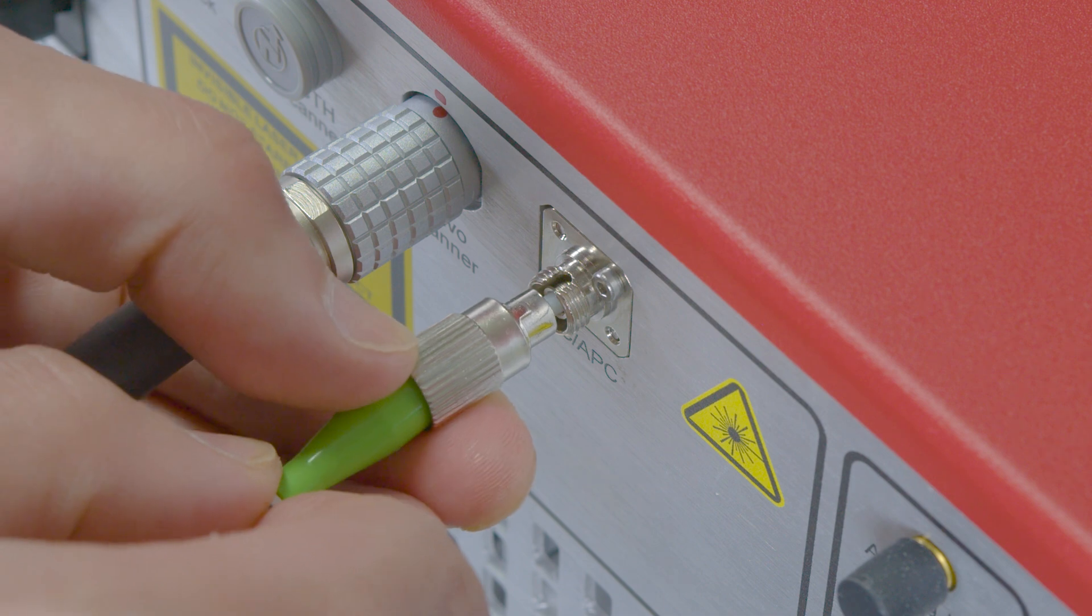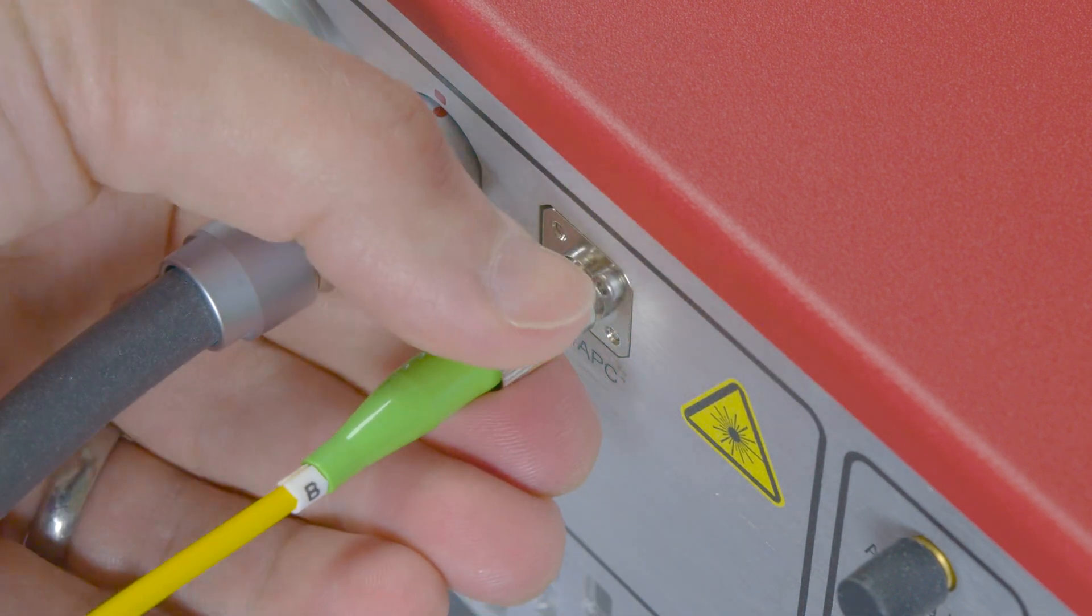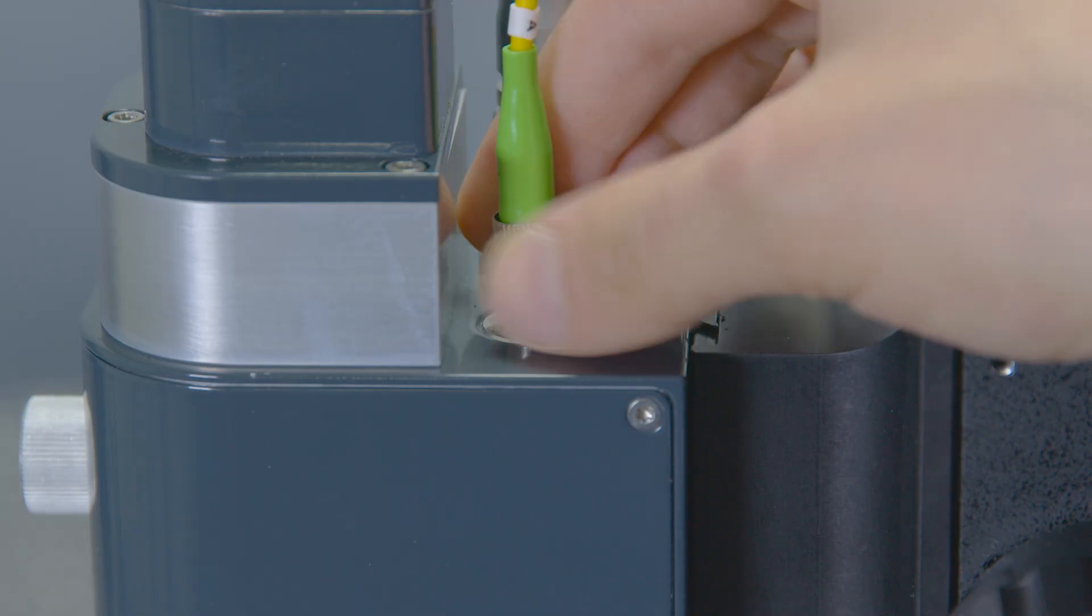Attach the fiber patch cable to the back of the OCT base unit and connect the other end to the scanning unit.